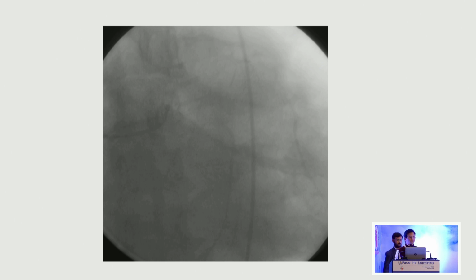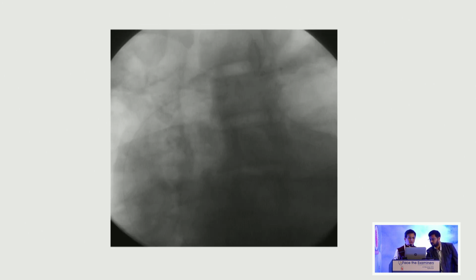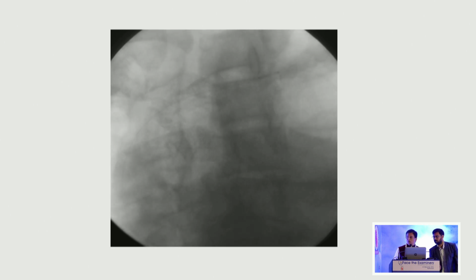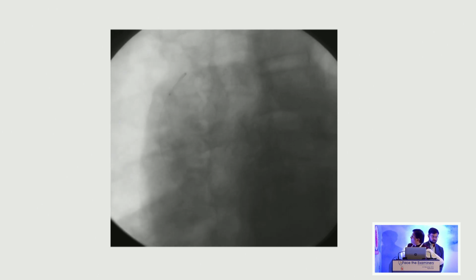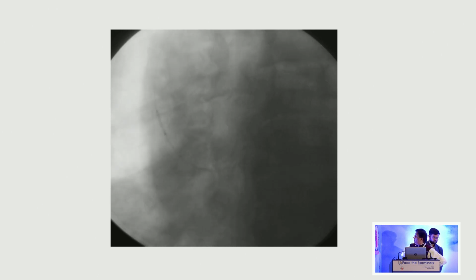Next. Oops. Sorry. Next. Next. Okay, can you see here? Okay, so now you can see what it is. This is very strange. You are seeing a stent on a guide wire.